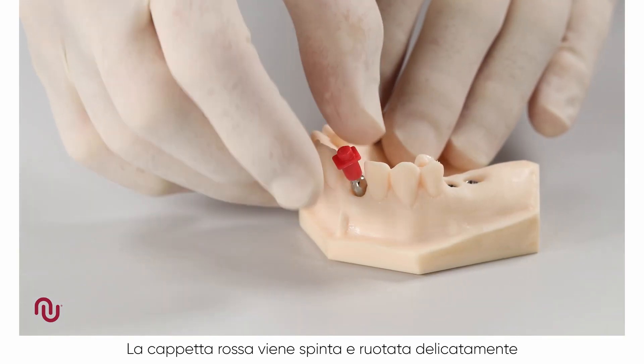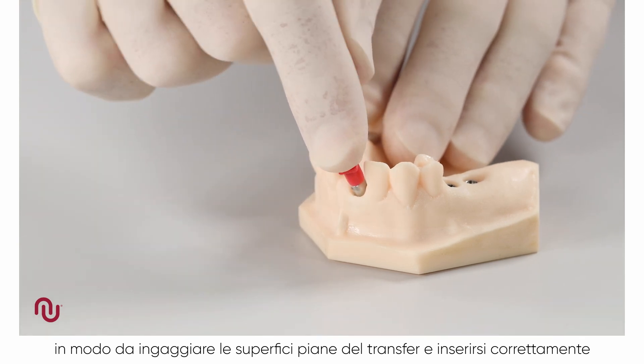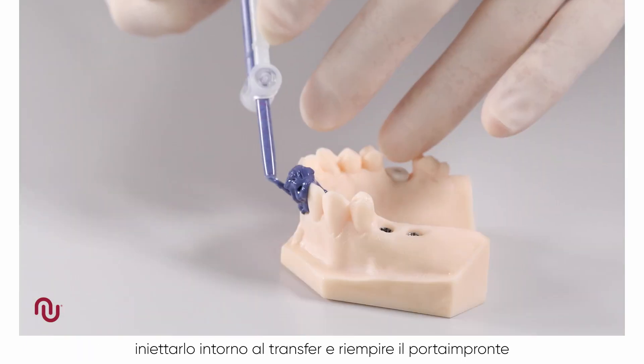The red plastic cap is then gently pushed and rotated to engage the flat sides of the impression coping and correctly seat it. We recommend using a medium to heavy body impression material. Inject around the impression coping and fill the impression tray.